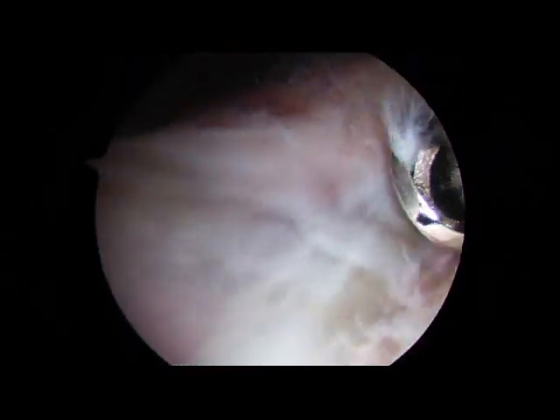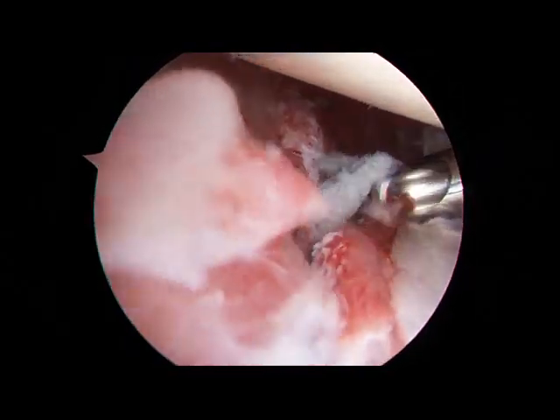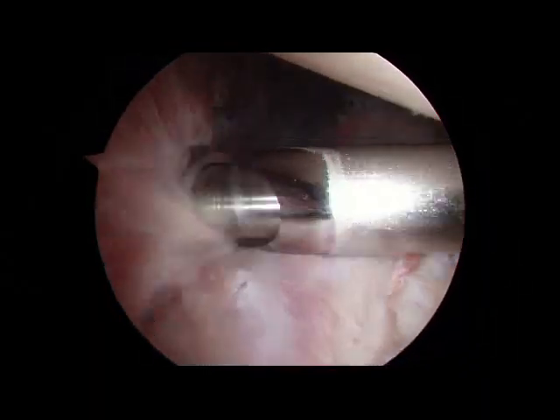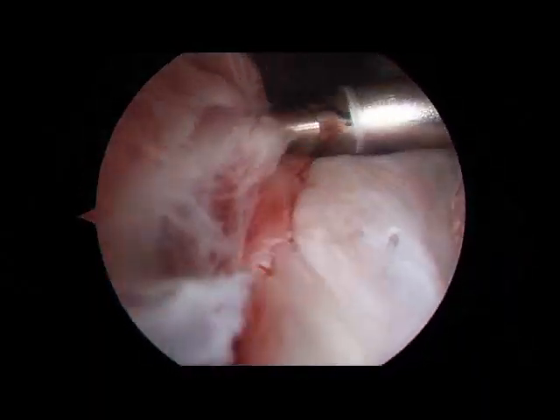So we did a posterior-inferior release. We're going to come through a little bit of the middle glenohumeral ligament here, and we're just going to move along and continue to clean this up.